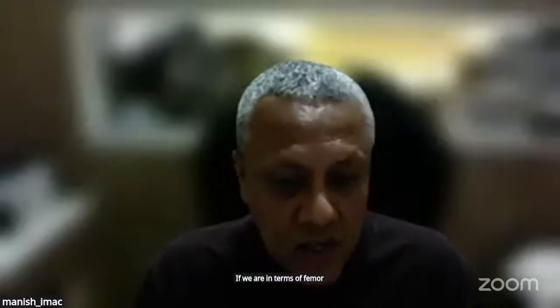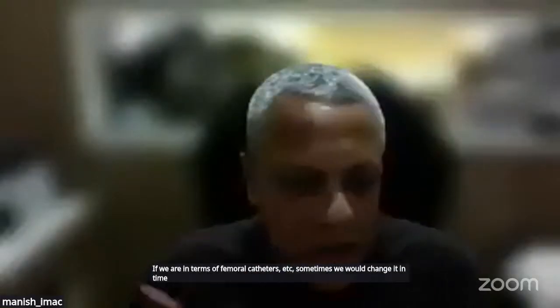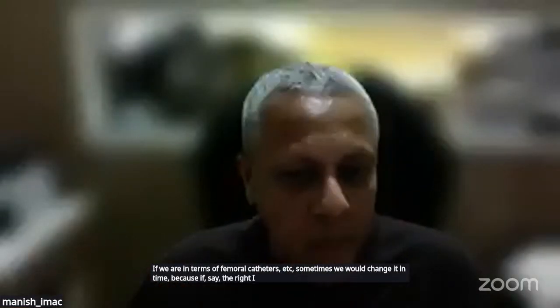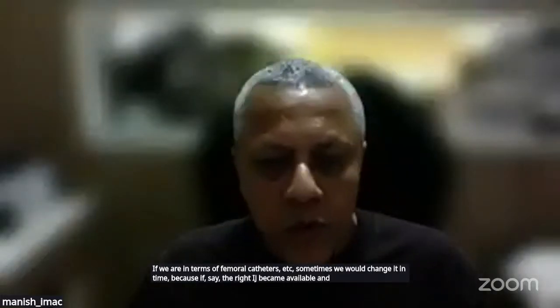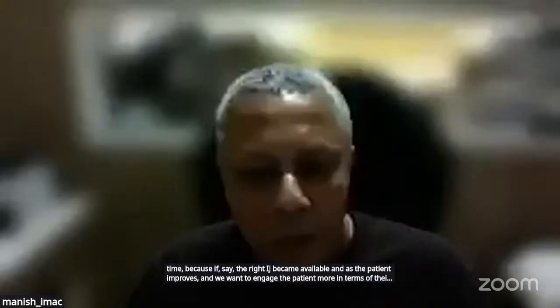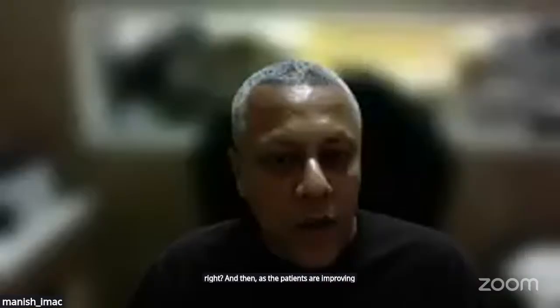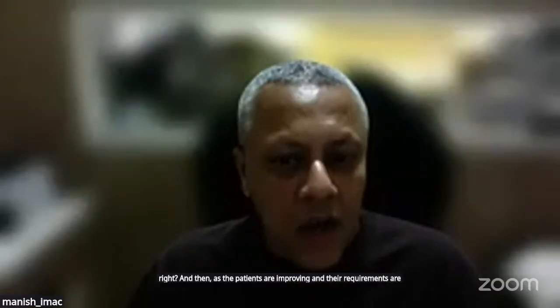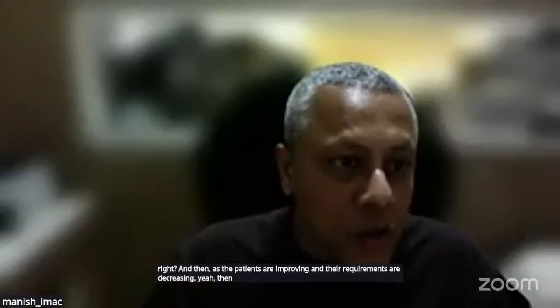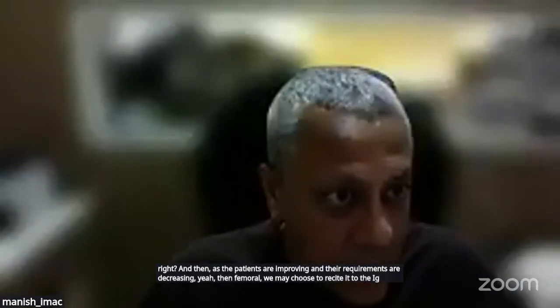With femoral catheters, sometimes we would change it in time, because if, say, the right IJ became available and as the patient improves, we want to engage the patient more in terms of their physiotherapy or their mobility, right? And then as the patients are improving and their requirements are decreasing, for femoral, we may choose to resite it to the IJ if that happens.